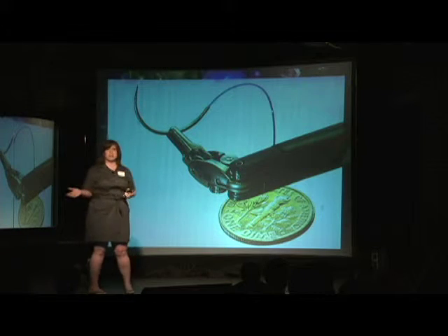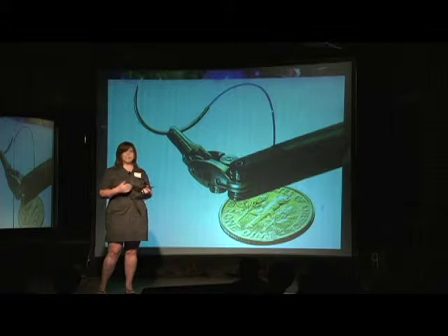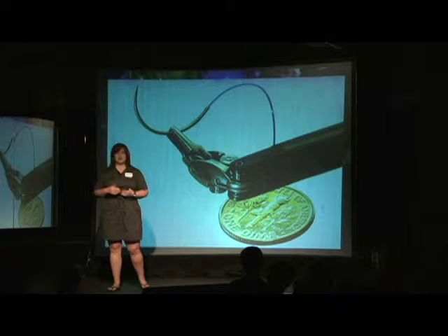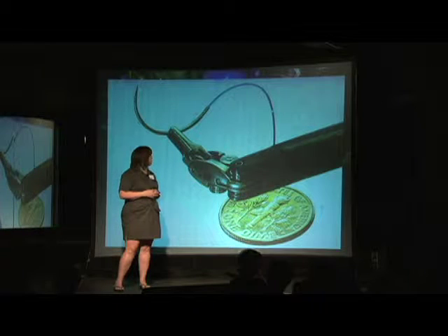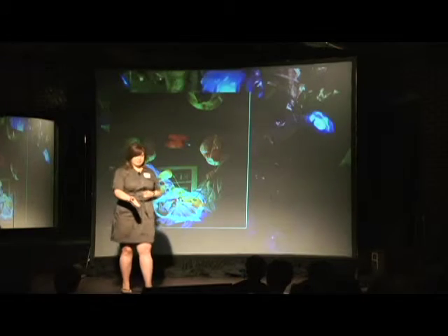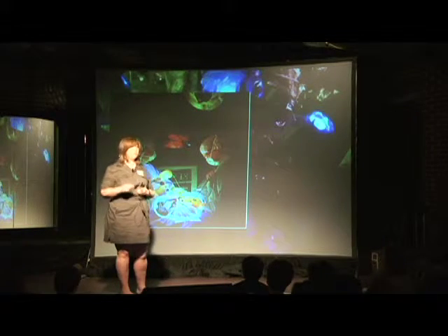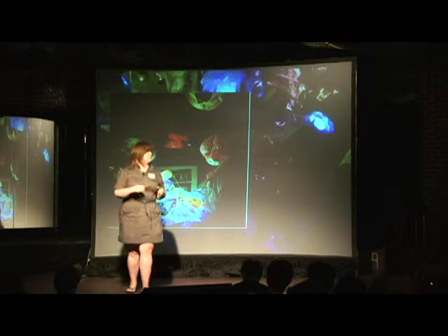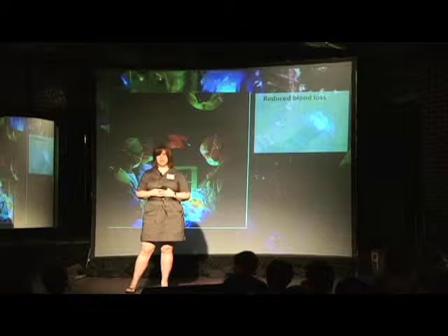It doesn't have a name, so if you think of anything, please let me know. But what that machine does allow us to do is allows the surgeons to do some pretty miraculous things. This here is the tower. It's part of the components of the robot. There's two other components of the robot. That is the patient cart and also the console in which the surgeon sits.